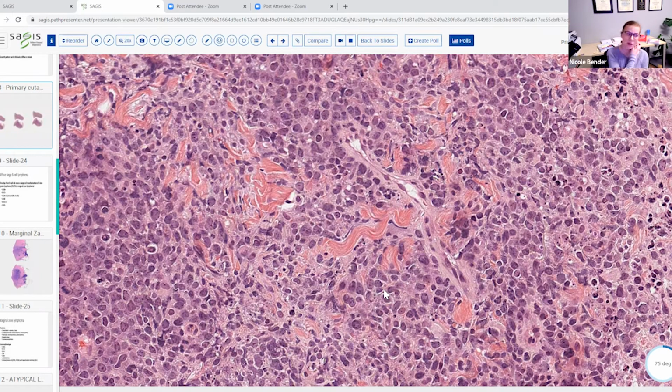type. This can mimic that diffuse pattern of follicle center lymphoma, but the single greatest criterion to differentiate diffuse large B-cell lymphoma from diffuse type follicle center lymphoma is BCL2 and MUM1. Follicle center lymphoma is BCL2 and MUM1 negative. MUM1 can be positive in some cells, which should be less than 30%. Diffuse large B-cell lymphoma is BCL2 and MUM1 positive. MUM1 should be seen in greater than 50% of the cells for diffuse large B-cell lymphoma.